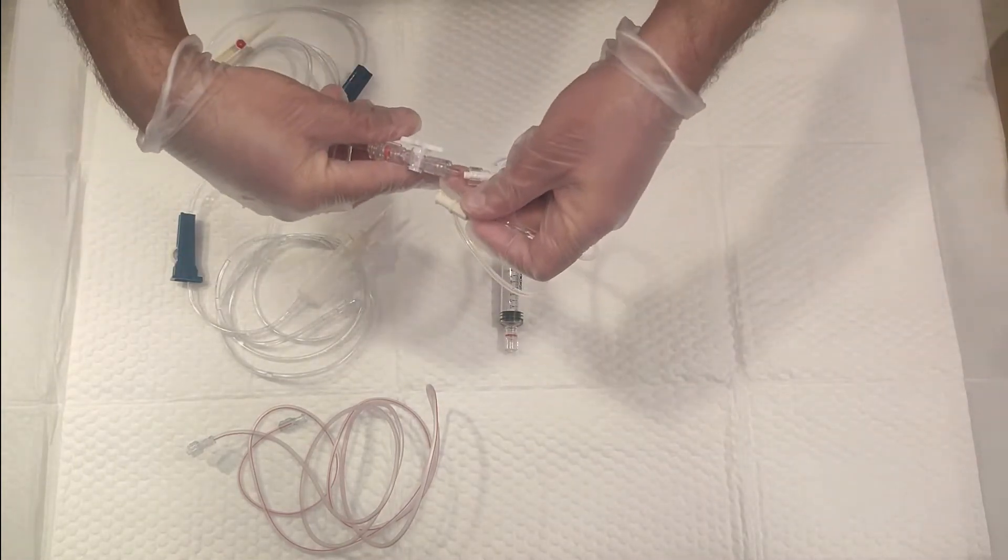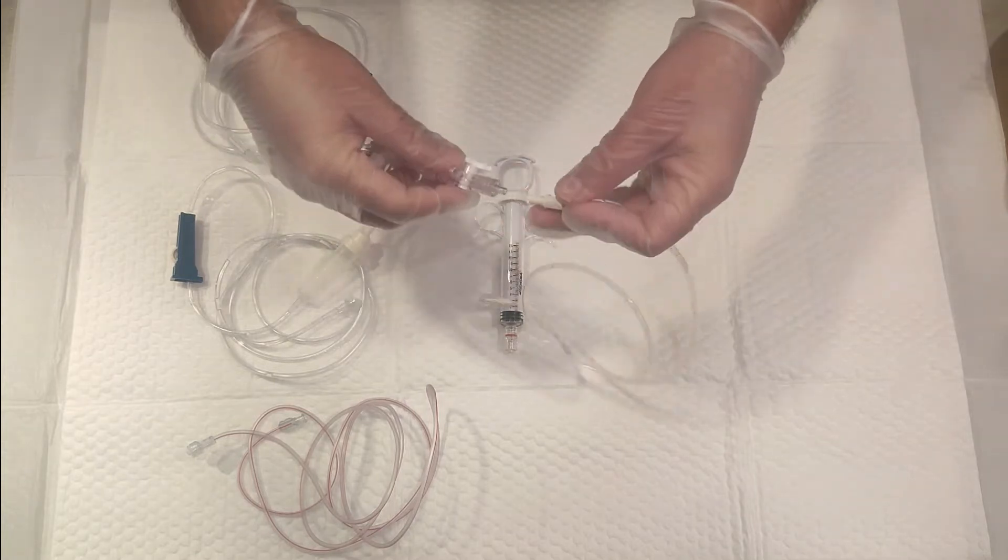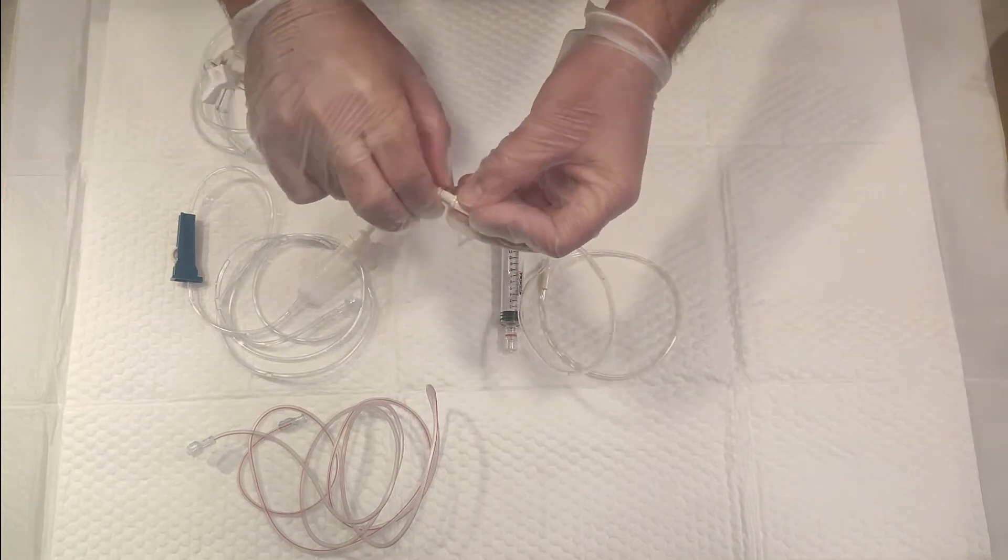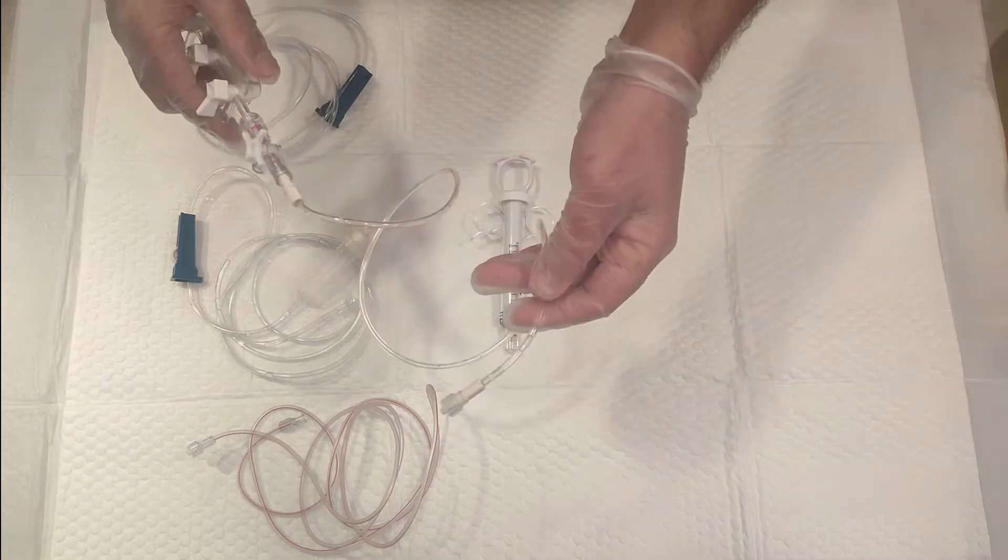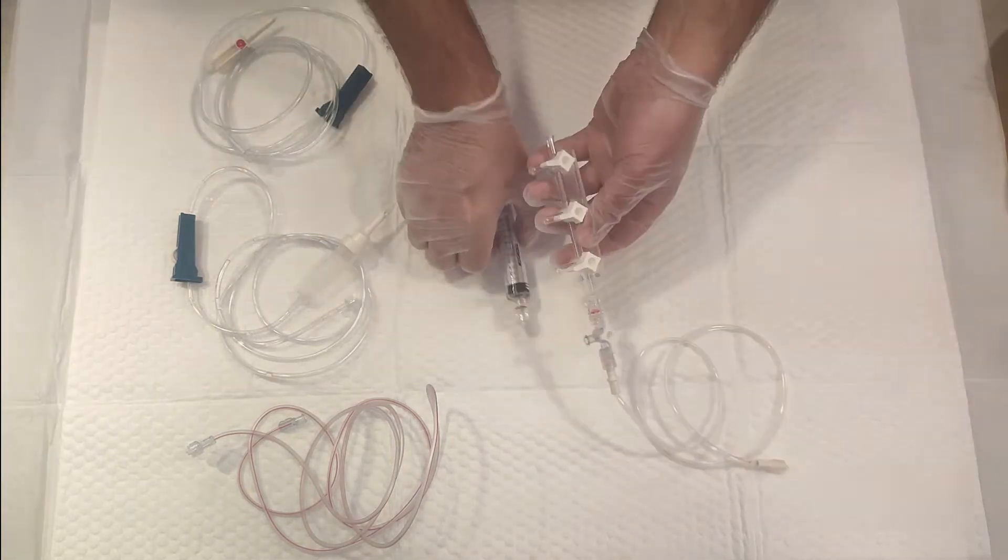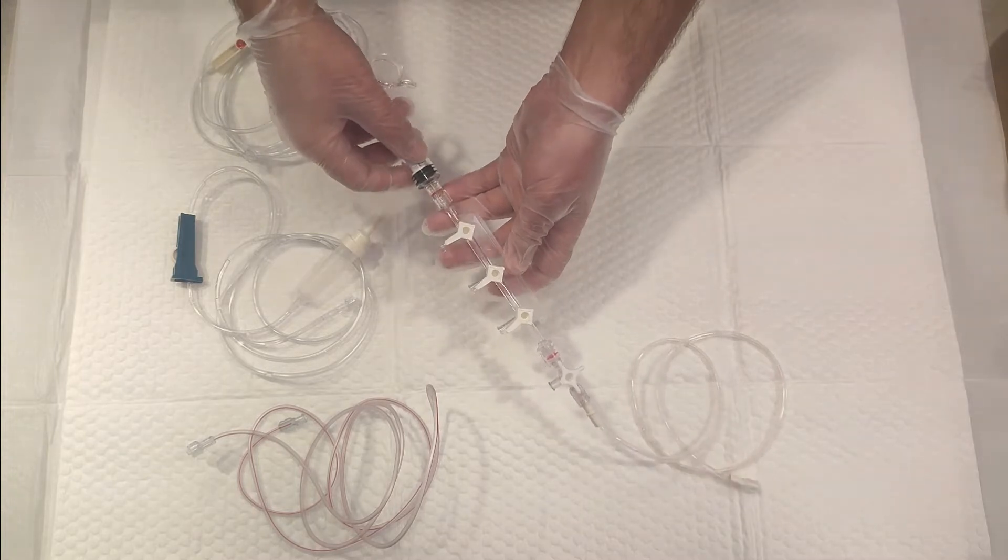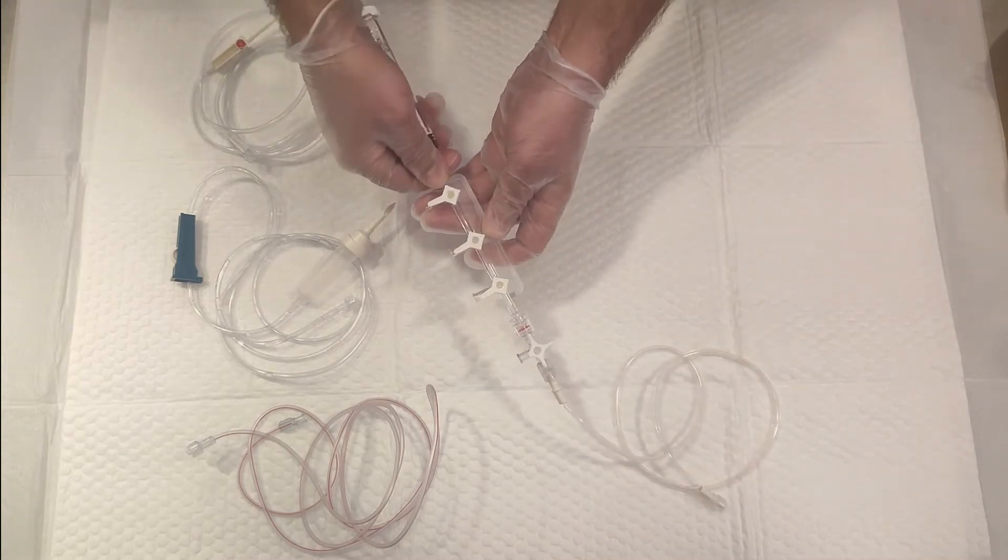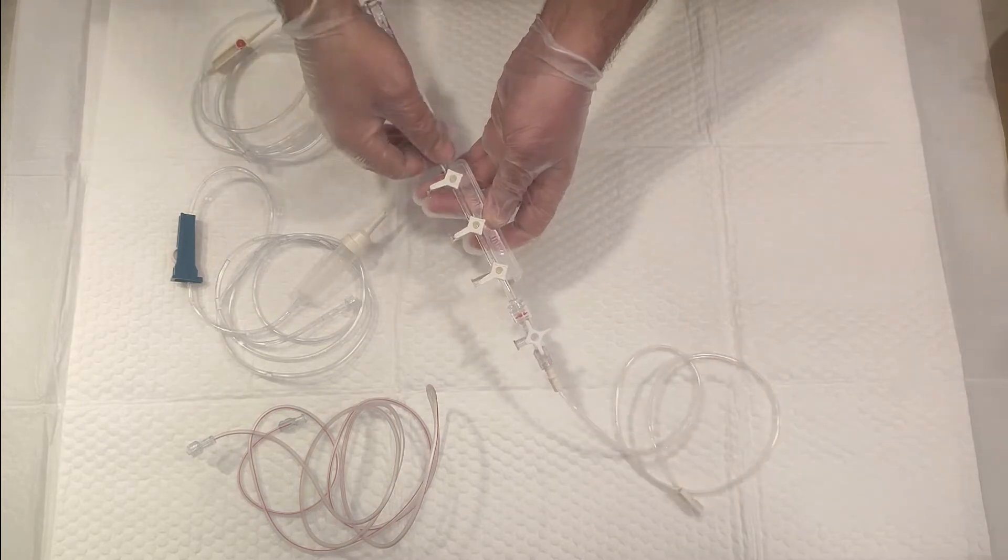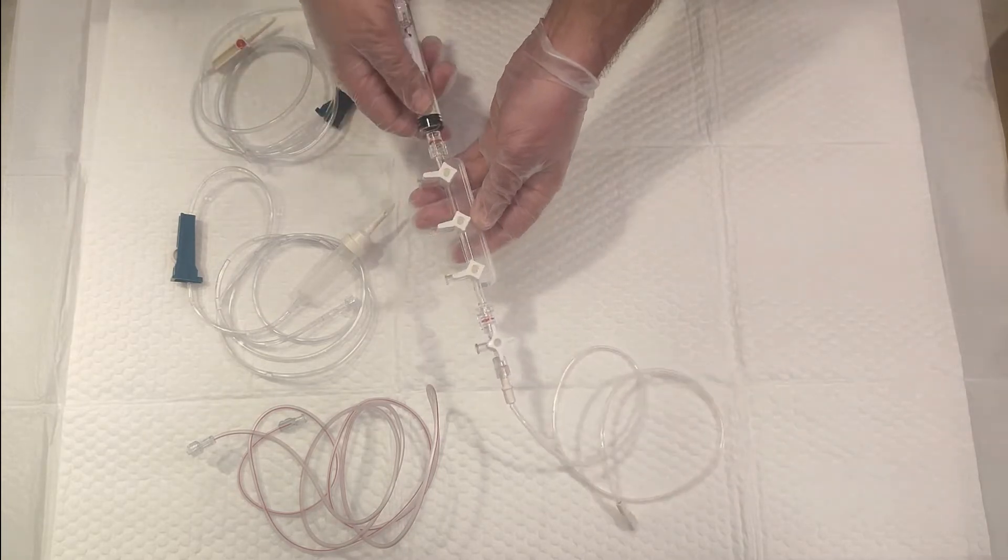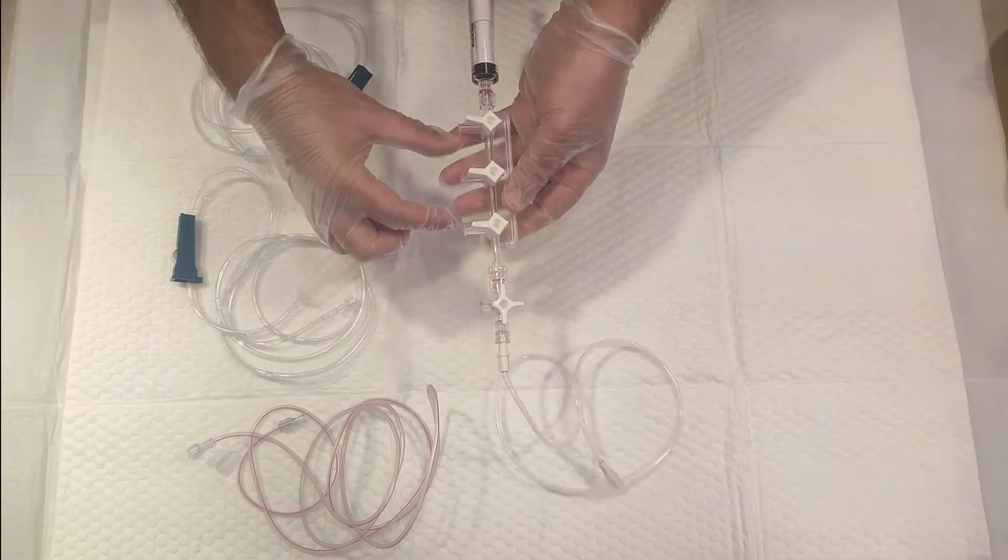It should be male to female. As you can see, if I try it this way, it won't connect. So male should go to the female side. Now it's extended. You can attach it to a high-pressure syringe at the other end. Just tighten it to avoid any potential error.